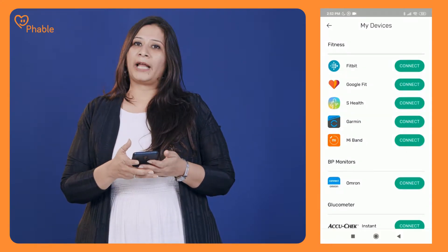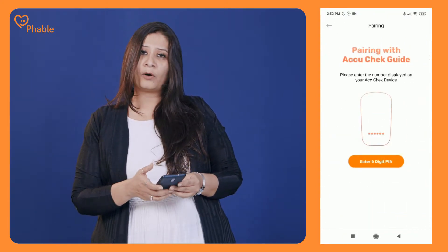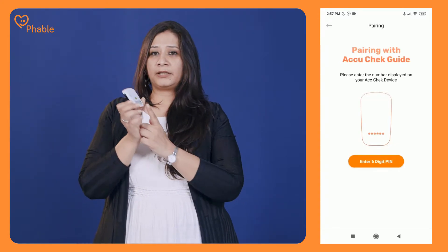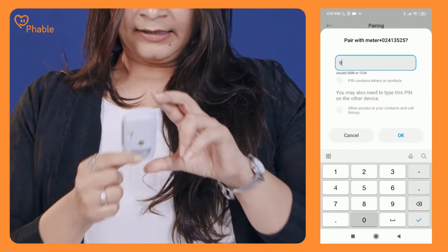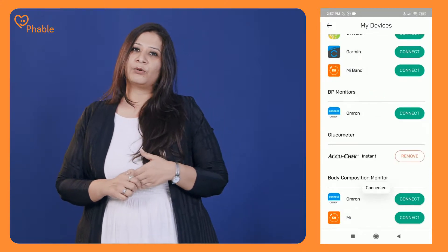Click on that and look for AccuCheck. Once you find it, click on connect. It'll prompt you to enter a pin number. The pin number is the same one that is mentioned on the flip side of the monitoring device. Enter that pin number and click on OK. The integration is now complete.